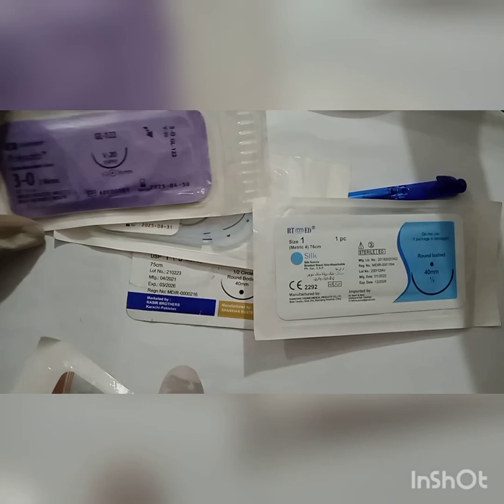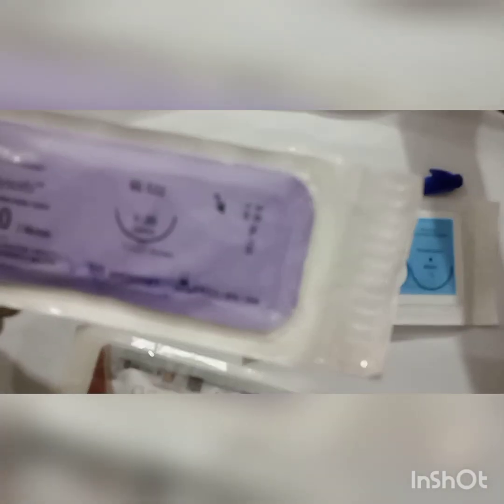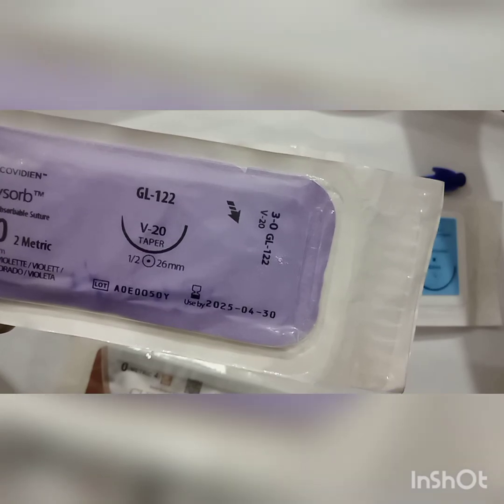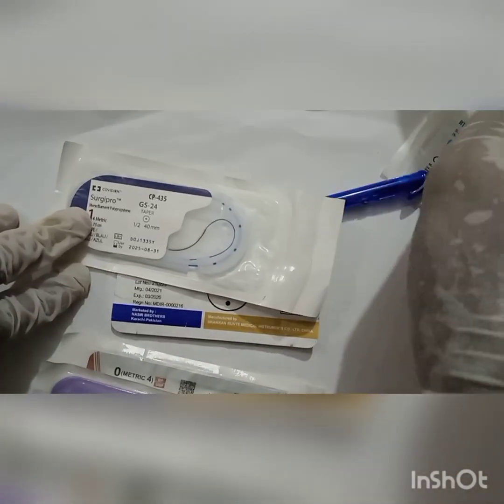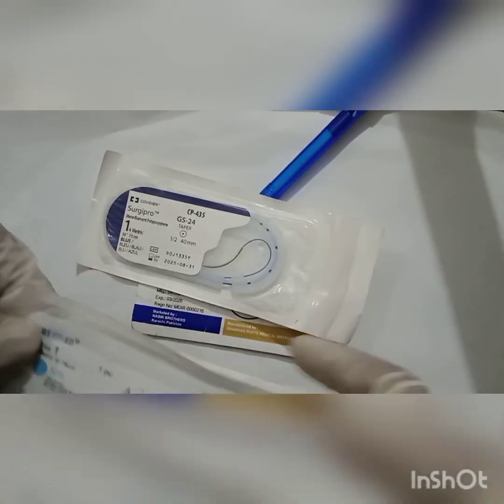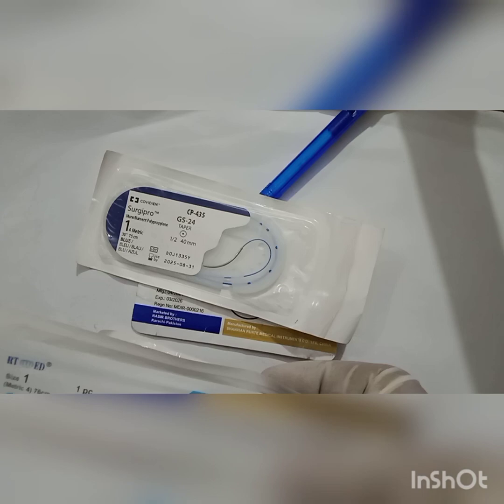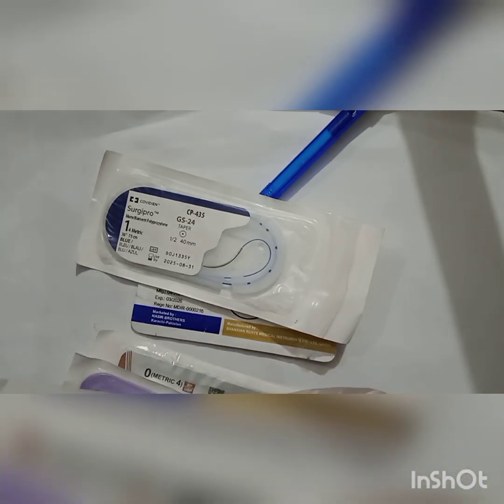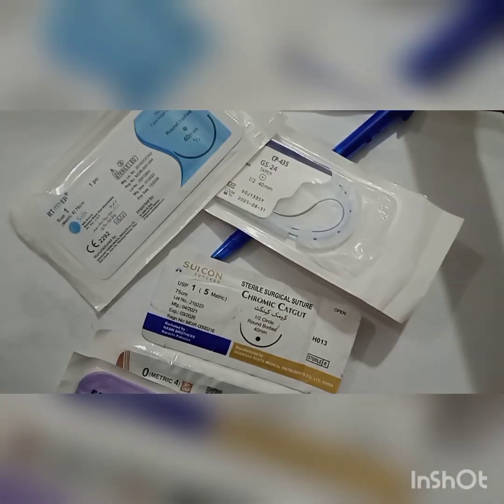Vicryl may have a duration of absorbability from weeks to months. And these non-absorbable sutures may not be absorbed completely, but they may lose tensile strength with the duration of time.